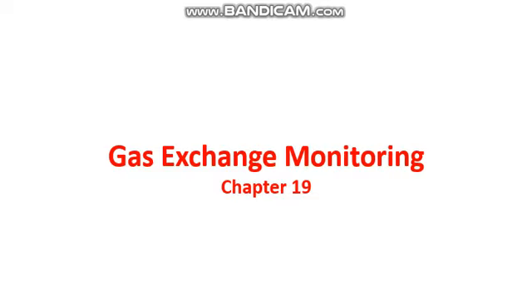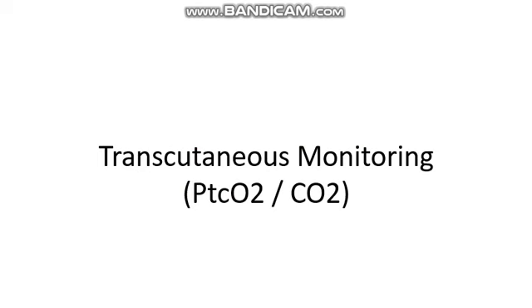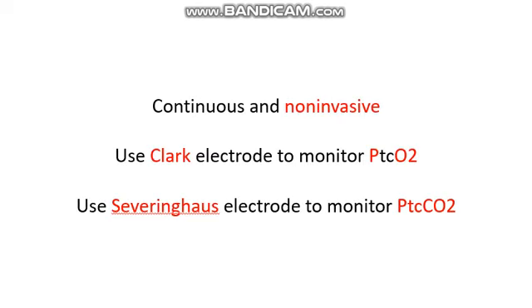Gas exchange monitoring. Chapter 19. Transcutaneous monitoring is continuous and non-invasive. It uses Clark electrodes to monitor TcPO2, and it uses Severinghaus electrodes to monitor TcPCO2.